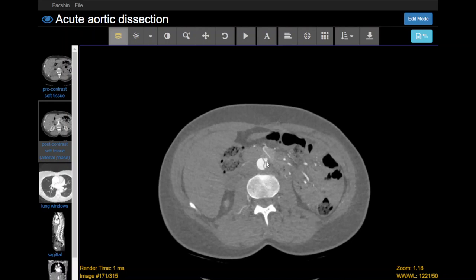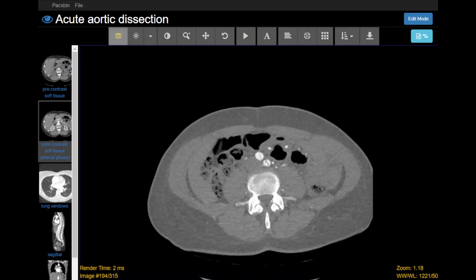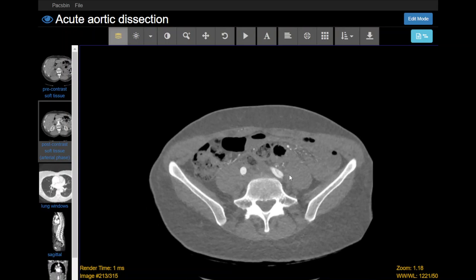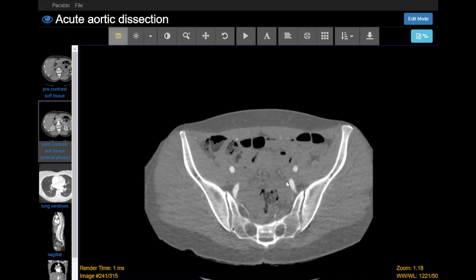Continuing down, we have the inferior mesenteric artery, which is always relatively diminutive. This is coming off the true lumen and is opacified. Then the aorta bifurcates into the common iliac arteries. The dissection flap extends into both proximal common iliacs. In the right common iliac artery you kind of lose it, but it does remain opacified. In the left common iliac artery, we see it extending all the way down. At the external and internal iliac arteries, you start to lose the dissection flap.